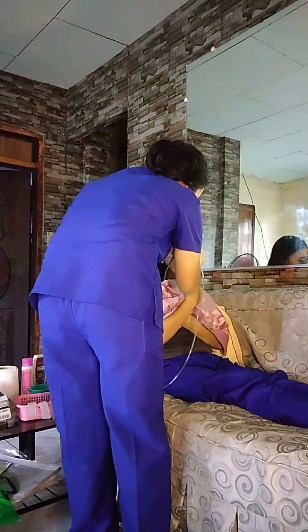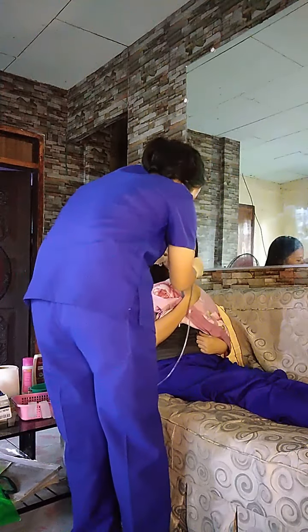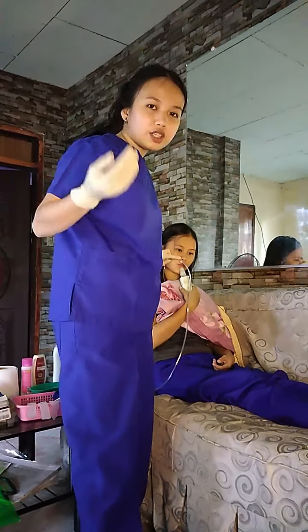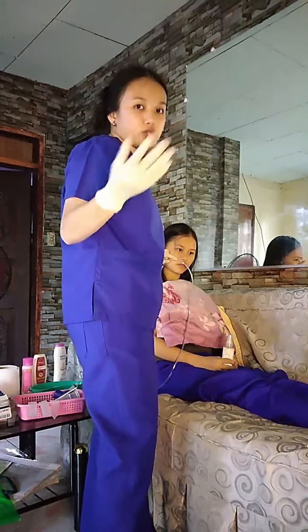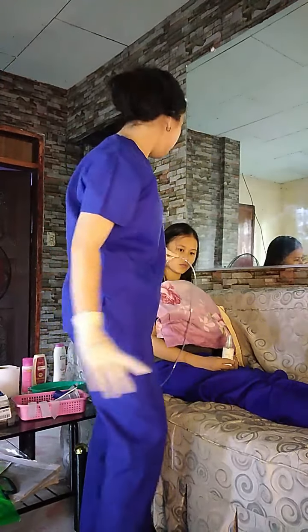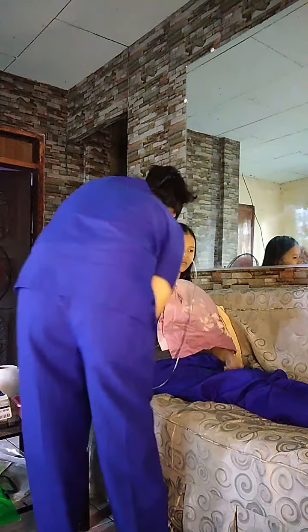Continue. Habang in-insert natin, mag-observe tayo kung may pagbabago ba sa appearance ni ma'am. Sa respiration, kung nagkakaroon ba siya ng cyanosis, or umuubo siya. So, ganun. So, since wala din ako na-feel na obstruction, isi-secure ko na yung, akin na po ma'am yung water.